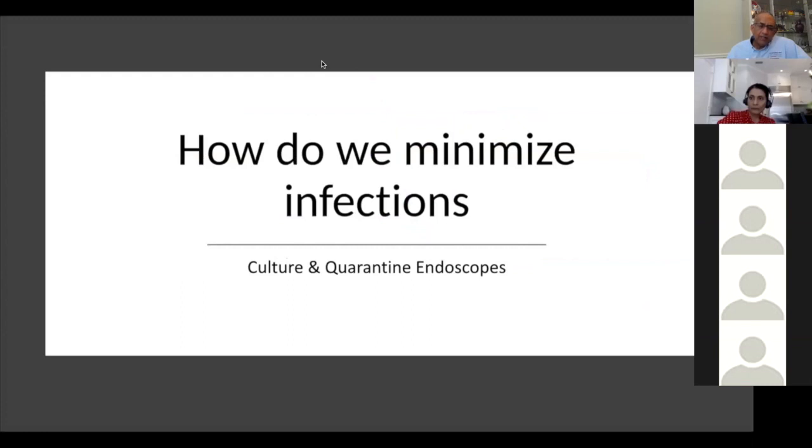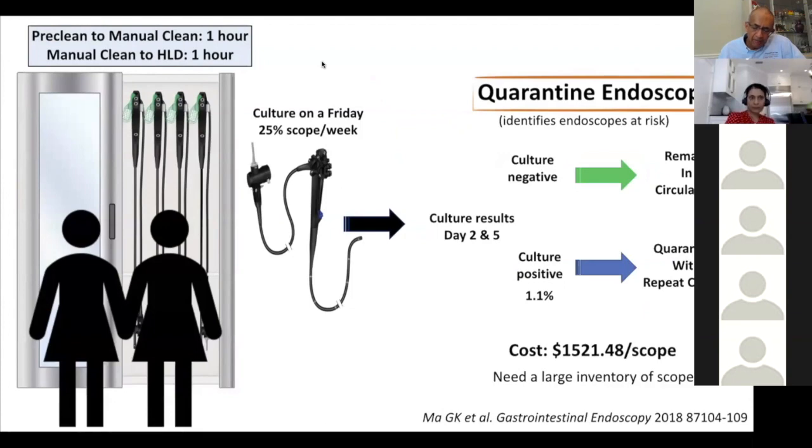So how do we minimize infections? After the CRE infections happened in 2015, there was a lot of interest in figuring out how we can actually assure our patients that we could minimize infection. This is a beautiful study that came from University of Pennsylvania. And the most important thing is here.